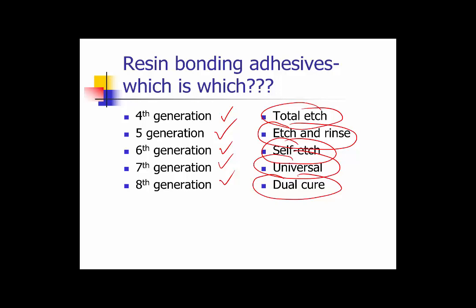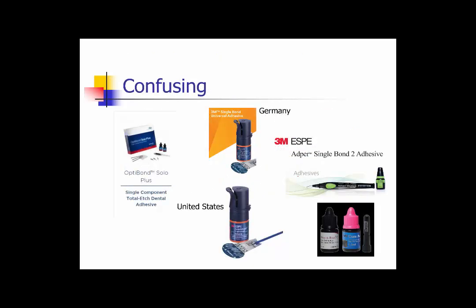You need to look at the instruction sheets and match up the technique with the material you're using, whether it be a light cure composite resin, a dual cure composite resin core, a composite resin dual cure cement, or a self cure cement. You need to understand and know these products. In fact, it is confusing.